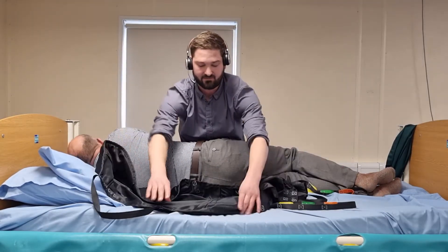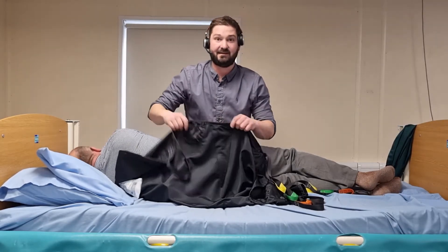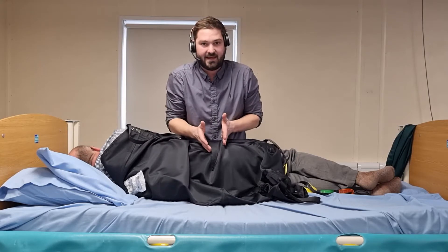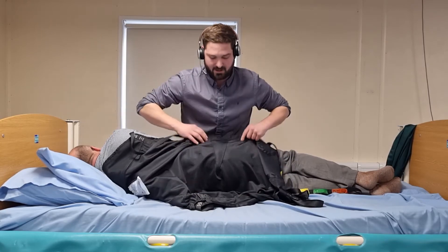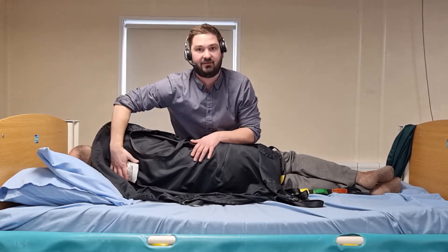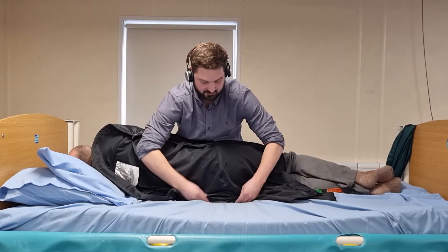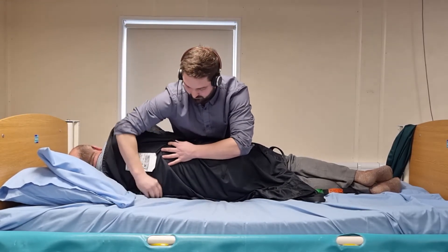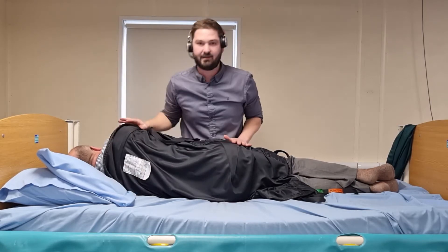While fitting this sling, this design does have an indicator stitched into the sling. This indicates where the sling is fitted over the service user — it comes over his hip and drops down. I'm then going to look at the top of the sling, check the label, and make sure the label of the sling is at the center of his back. Once these are in a good position, I'm going to use the softness of the mattress to push the sling underneath his body.